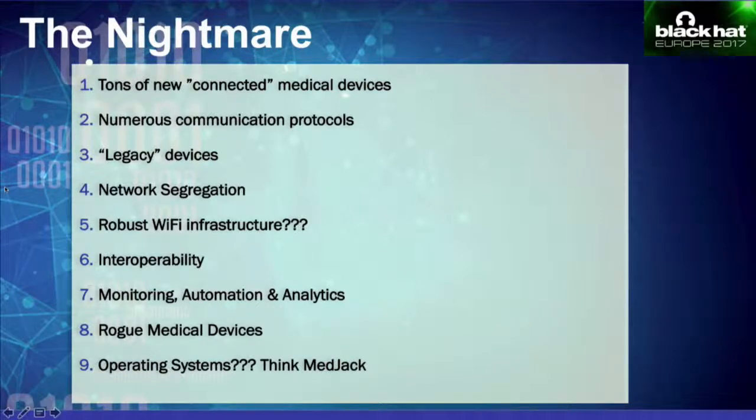And then patching. You can think of these medical devices as industrial control systems. Actually, in a way, they are industrial control systems. And so a lot of them come with old hardware. They have older operating systems, just the way that they work around the clock. It's not easy to patch them. In fact, most of these devices are heavily and strictly maintained by the manufacturer's own technicians. So even if hospital IT staff wanted to do something about it, they don't have much insight into these medical devices. They don't have any protection against malware, etc.